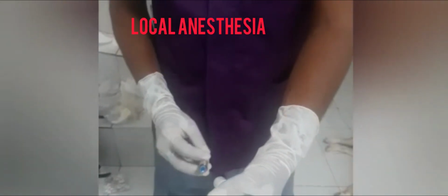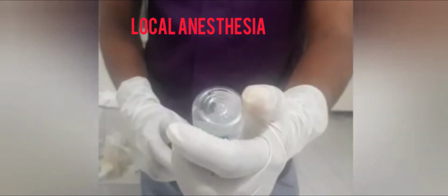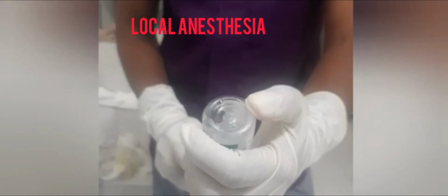For a local anesthesia, you need an anesthetic drug like lidocaine and a syringe. First of all, get the local anesthetic drug into the syringe and remove the needle and get a new one.